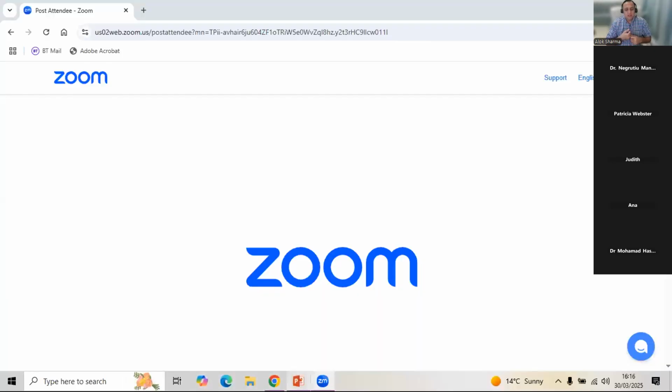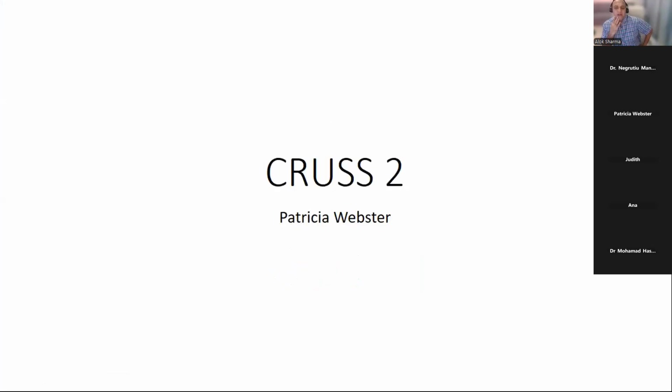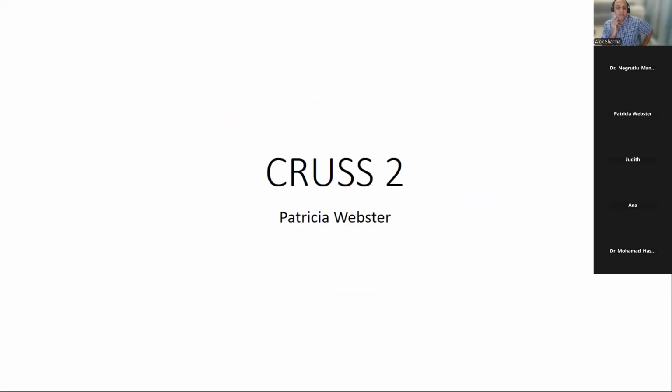That being said, if I want to make a diagnosis of kernicterus, I would be going straight for an MRI. It would give us a lot more information. After a few weeks of having had the hyperbilirubinemia, you may start seeing basal ganglia and thalamic changes, chronic changes, where again you see hypo and hyperechoic differentiation. It needs very good resolution on your probe to be able to do that. My experience is it's just better to get an MRI done in those babies. It's better for prognosis as well, if you can.